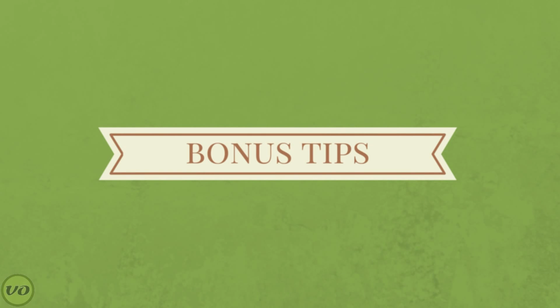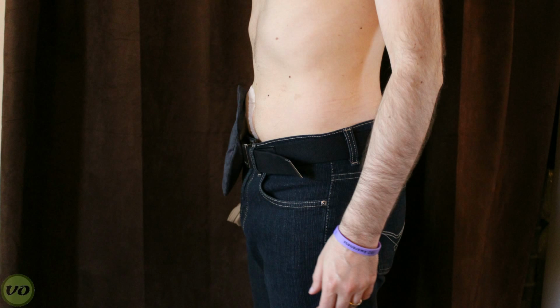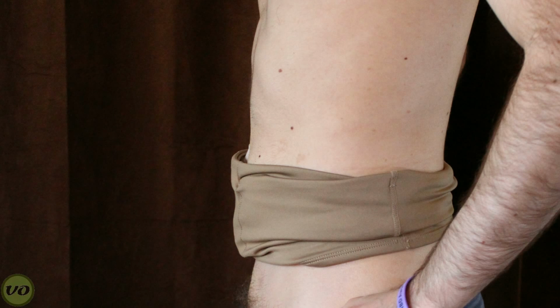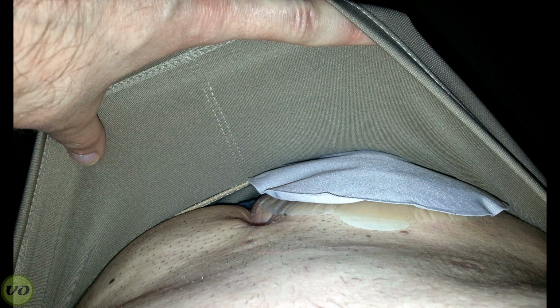Now, here are some bonus tips that I think you can apply all around when it comes to dressing with an ostomy. Now, the first tip that I would offer is to always make sure that you keep your pouch as empty as possible. As your pouch fills, it takes up more space, it becomes heavy, and it generally makes things more difficult when it comes to wearing clothes. If you have your pouch underneath your pants and it's really full, that's going to be uncomfortable. It's not going to allow you to bend properly. So try to make sure that you are emptying your pouch before it gets to about a third full. And that's especially important if you're wearing something like a wrap or a stoma guard that might already be lessening the capacity of your pouch.